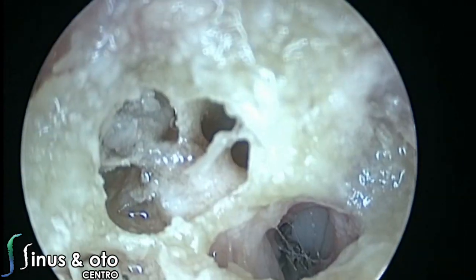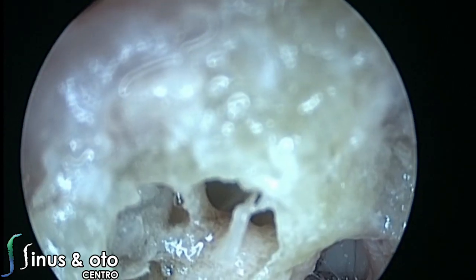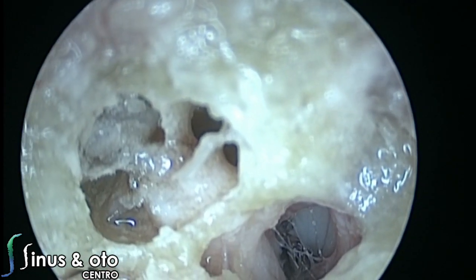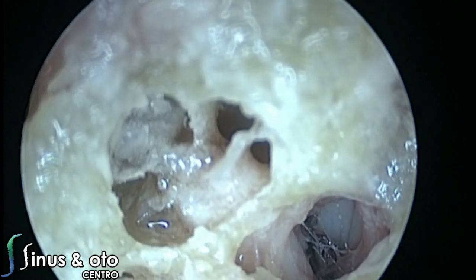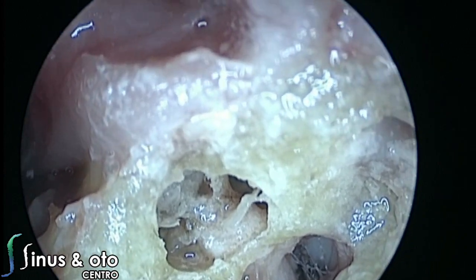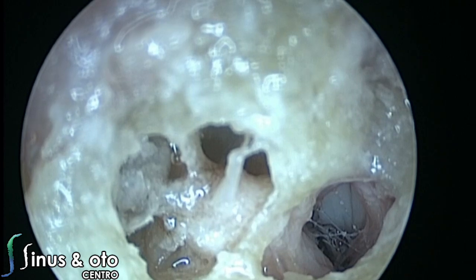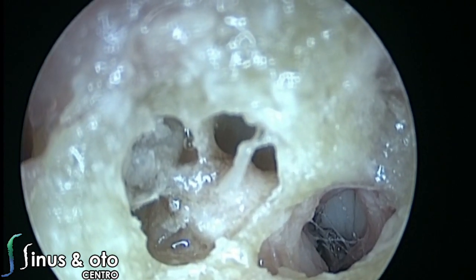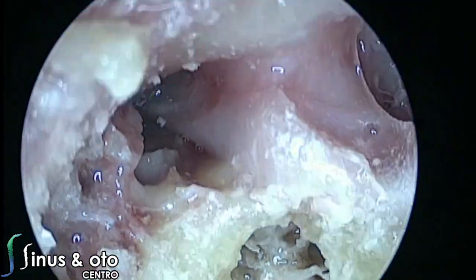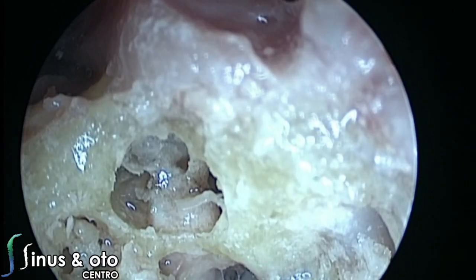When you do a translab approach, although the same anatomical structures, they are in a different anatomic configuration. And when you do an endoscopic approach, a transpromontorial approach like this one, you have the same structures with different configurations also. So it's very important to understand this concept, and to understand that although they are the same anatomical structures, according to the instrument that you use to see them, and according to the approach that you use to locate them, they can have different views or different configurations.